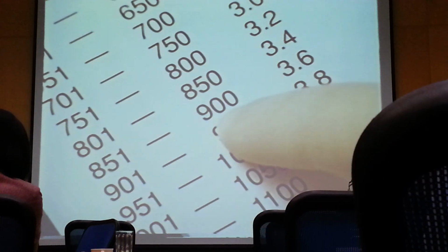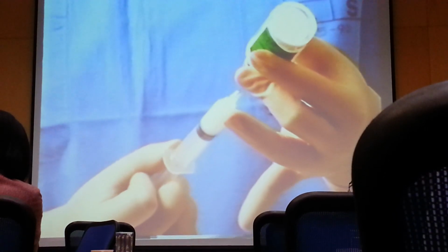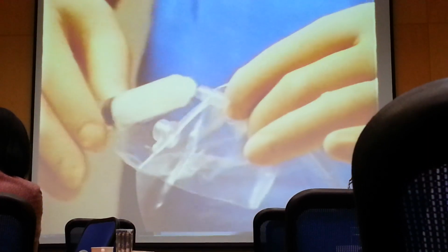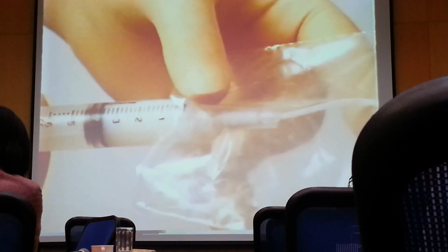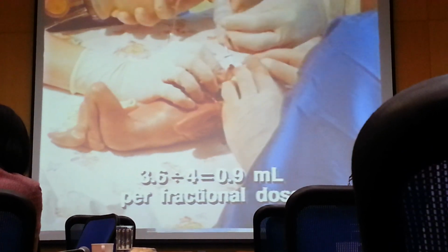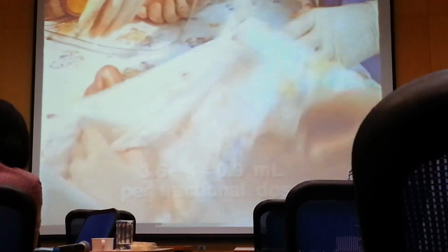The specific dose of Surfactant is based on the infant's birth weight. Using aseptic technique, draw Surfactant into the syringe. Attach the modified catheter. Expel the excess through the catheter, priming it, and leaving the full dosage in the syringe. The clinician will give the drug in 4 fractional doses, each with the infant in 1 of 4 positions.